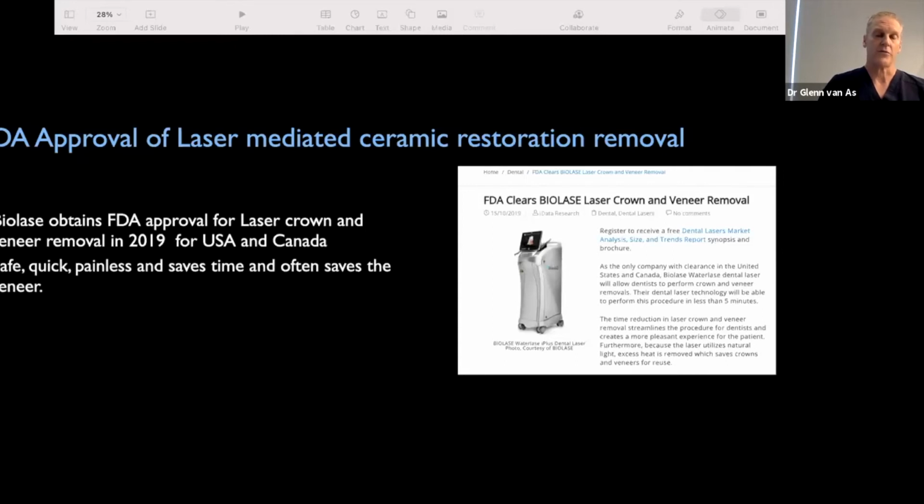So I've had situations where a patient has, we had one case, I'll show you a case in a second, but we had one case where a patient came in, the associate had been in the office, he used an opaque cement to rebond on the veneer. And of course, it was a central, and there was a dramatic difference in the color between the two centrals. So much so that the patient asked for the other veneers to be removed so that they could use the opaque cement to whiten the case. So I was able to get the veneer off, the single one, and use a clear cement that when the principal dentist came back, he bonded the veneer in with a clear cement and was able to reuse it. So again, it is something which can be used for many procedures. You know, it's the first laser company with FDA approval for this.